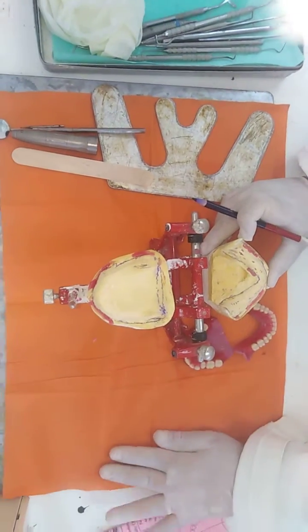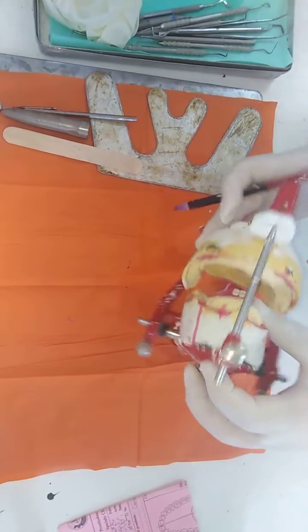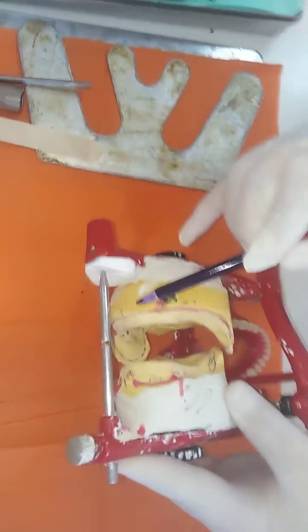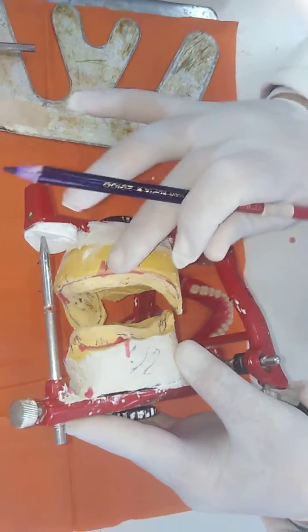This is another case of bone relation class 3. What do we mean once more by bone relation class 3? The mandible is protruded to the front. This is the patient in RCP. You find that the mandible is advanced in position in comparison with the maxilla. This is a class 3.